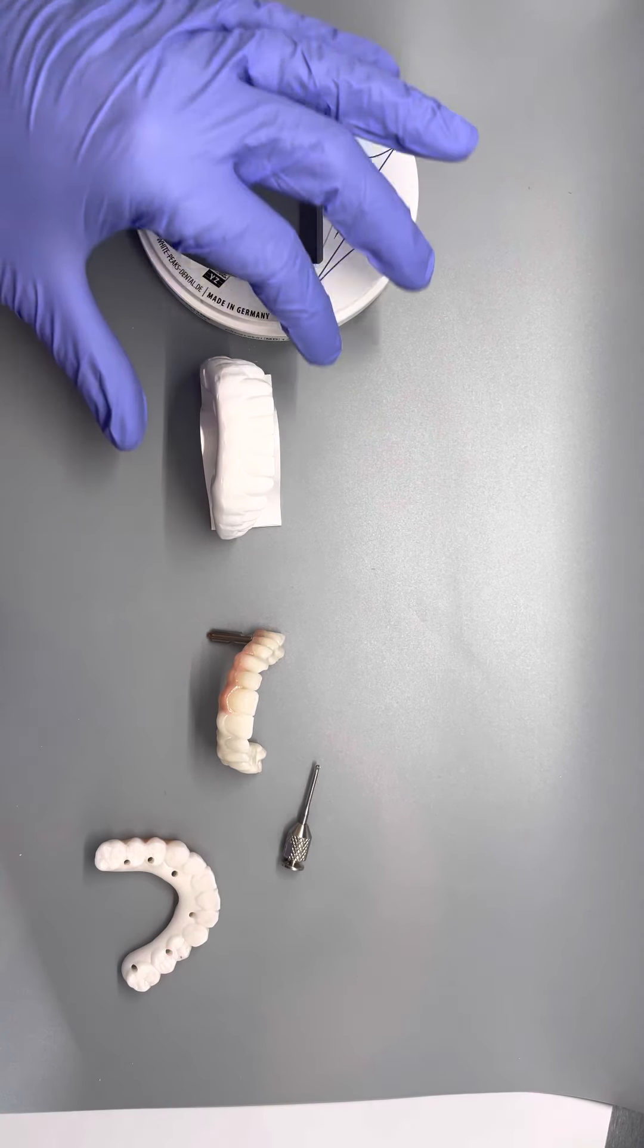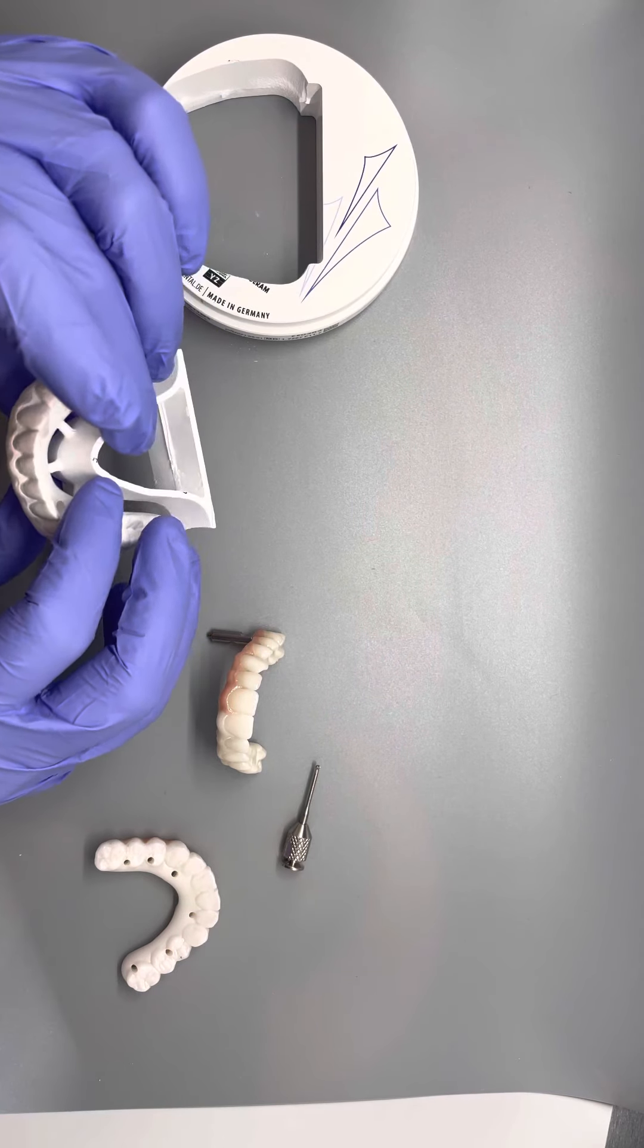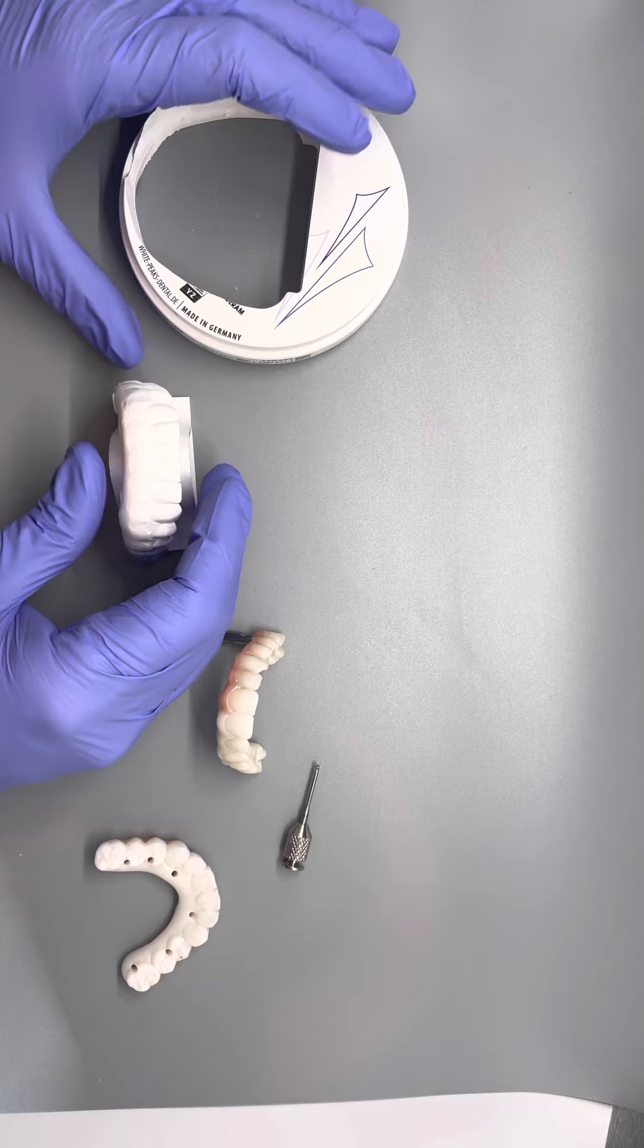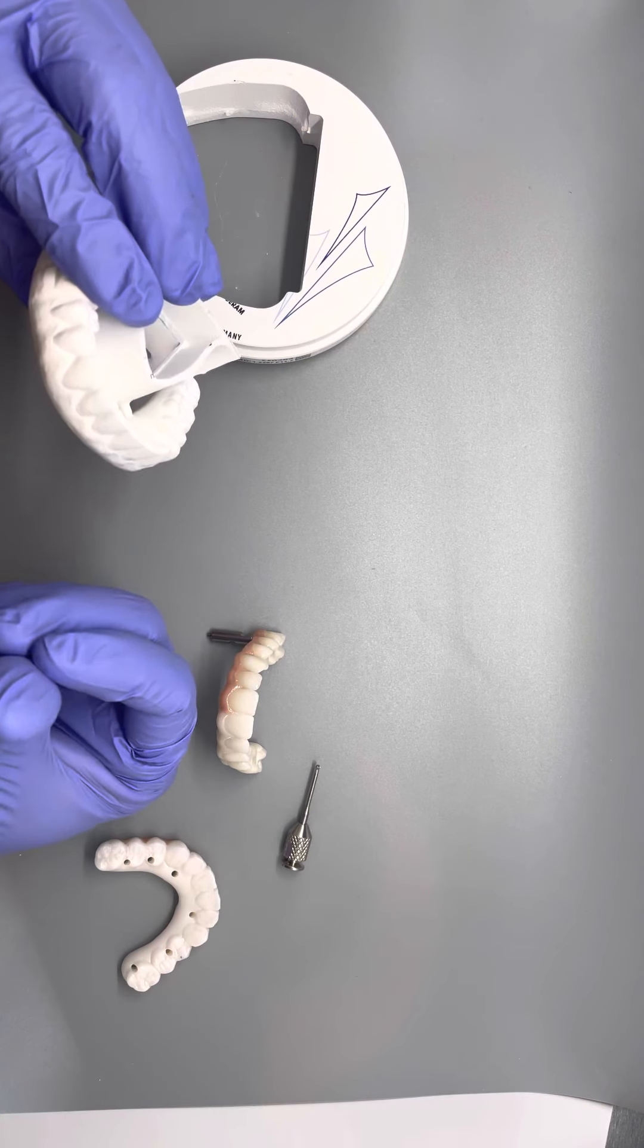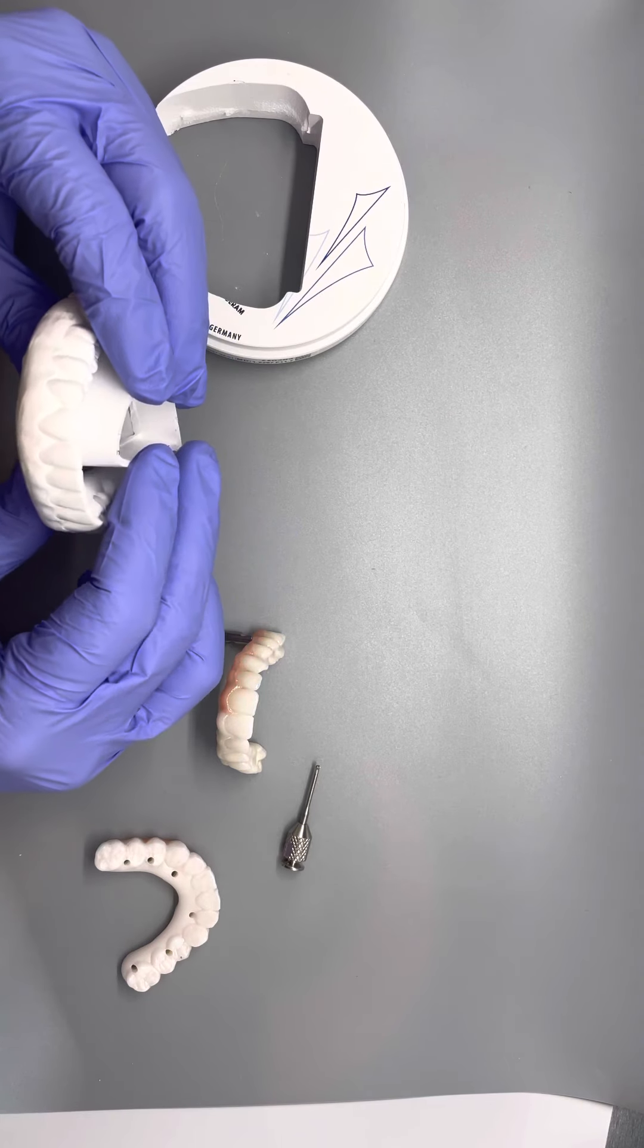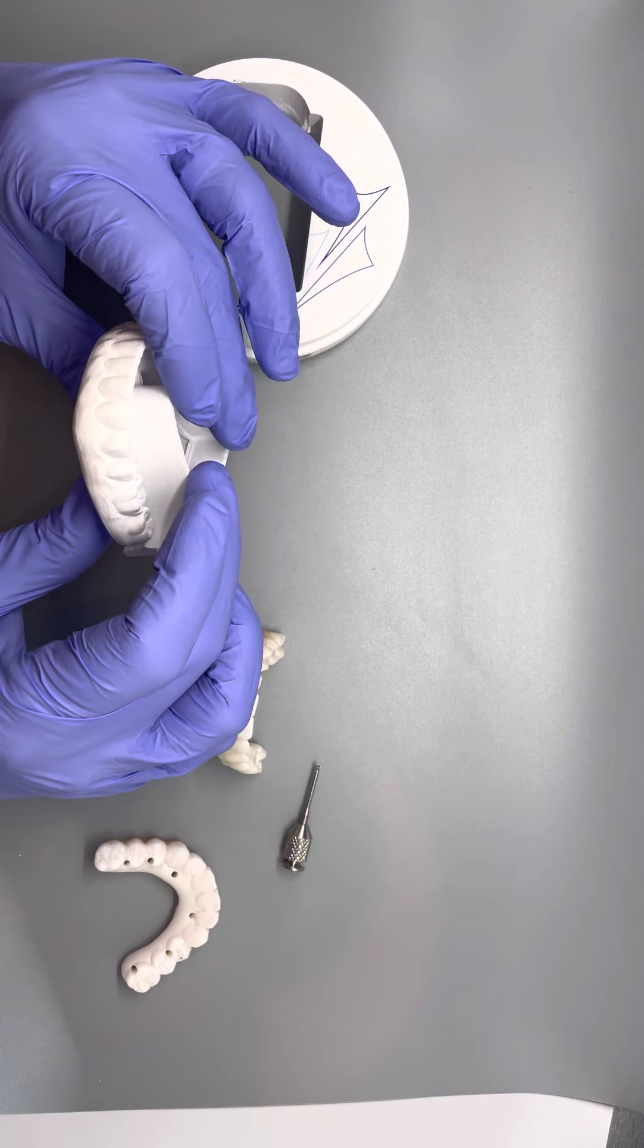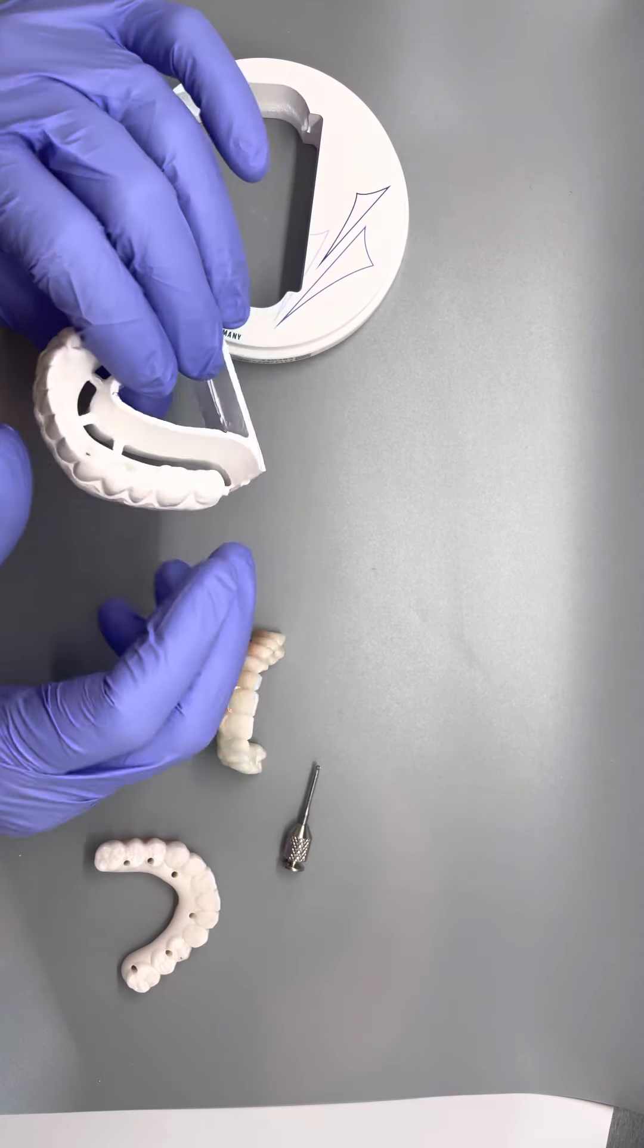So first we mill the screw denture out of this puck right here. You can see how that kind of fits right there, and so you'll notice that it's real white and it is kind of chalky actually. You can scratch this. So in this stage right here it's pretty weak. It is literally like chalk. It is just compressed powder is all that it is.